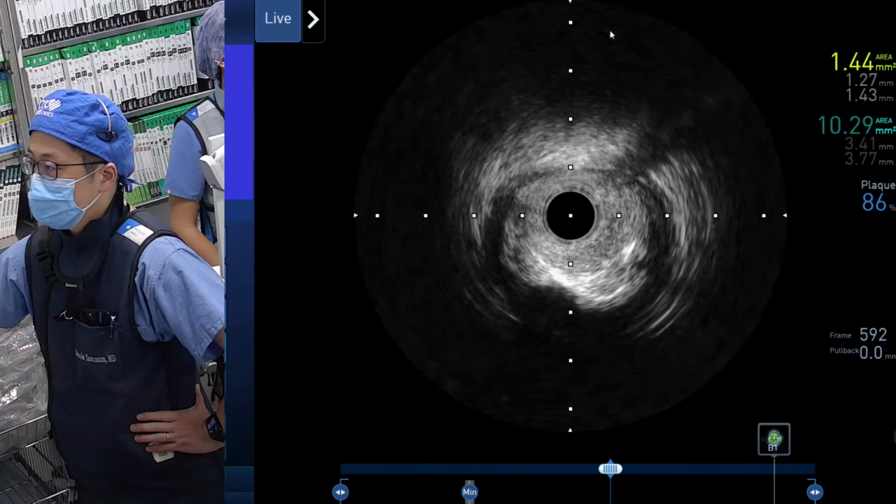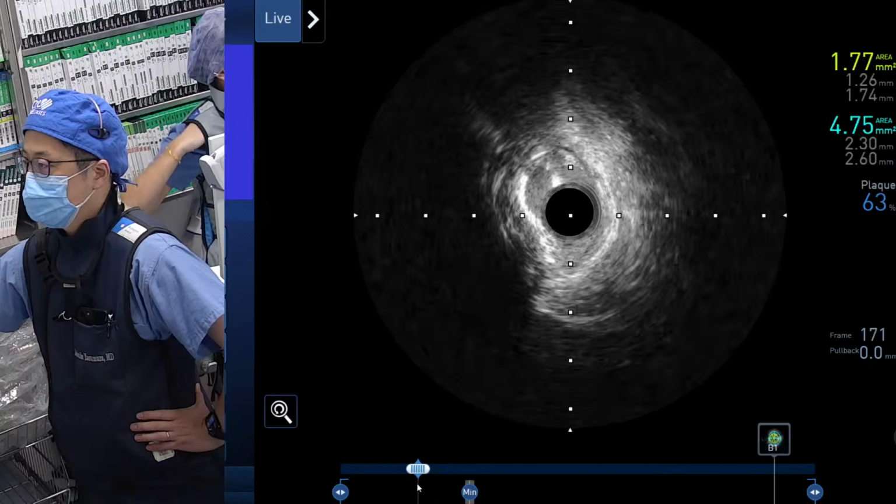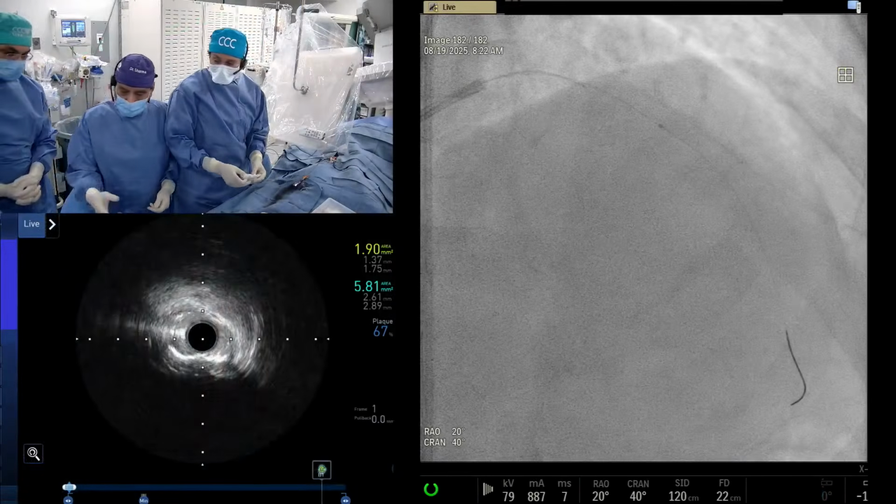No, but your trial is telling the right thing. Tell us about the nodule shock trial which you're trying to do. Please, let's get a rotor wire. Let's get the rotor wire, 1.5.